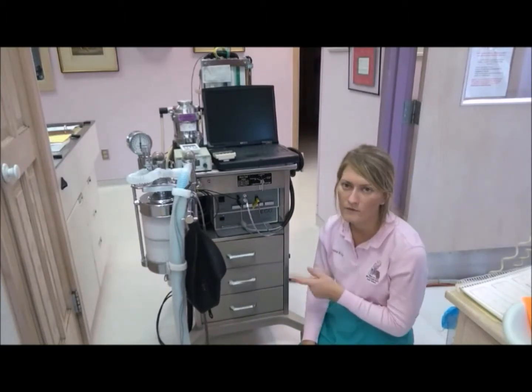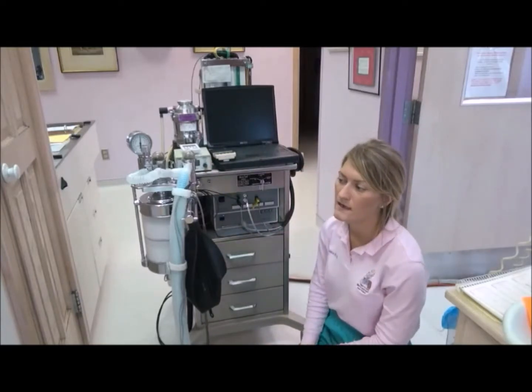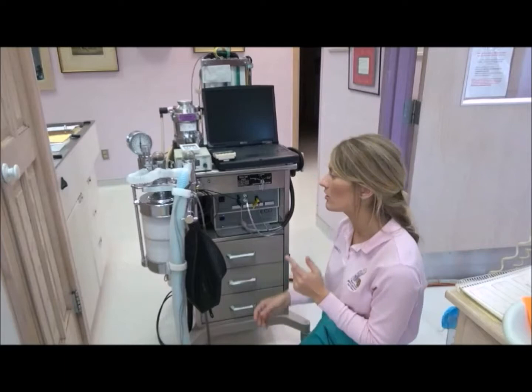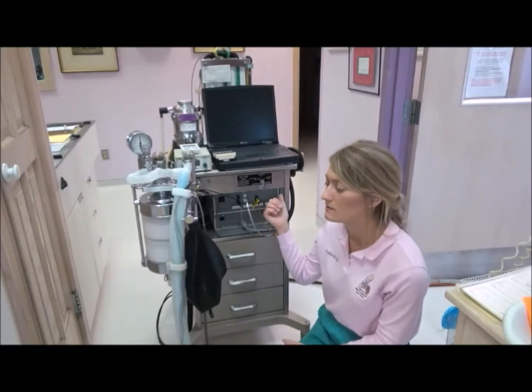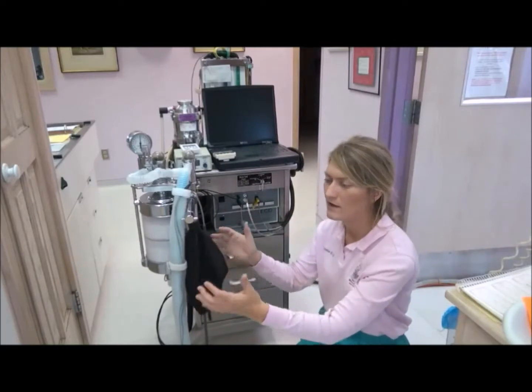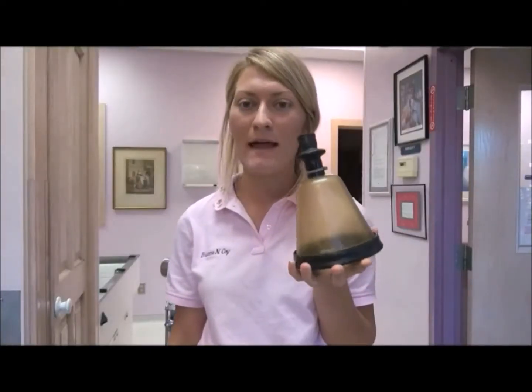So that's helpful to use at the end of a procedure when you want to flush out the lines, clear all the anesthetic out. Or if you have a patient and you need to perform CPR, that's really important because it'll deliver that large amount of pure 100% oxygen to the bag, and it'll allow you to ventilate the patient.